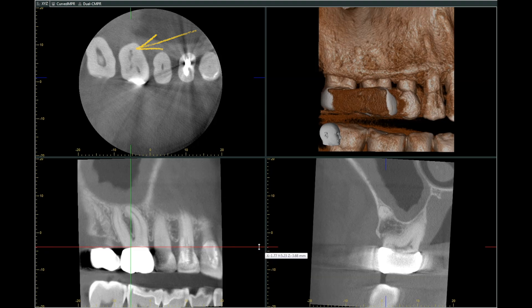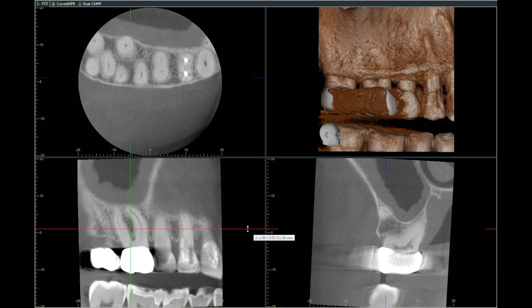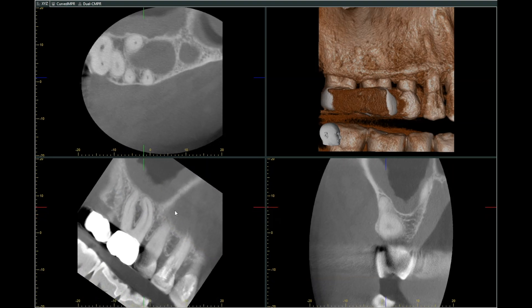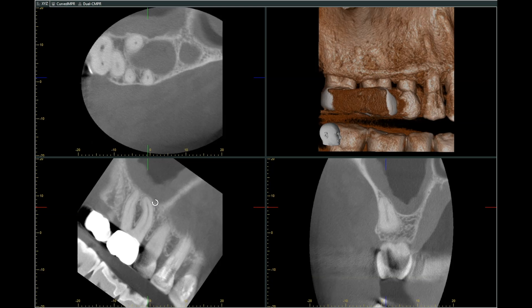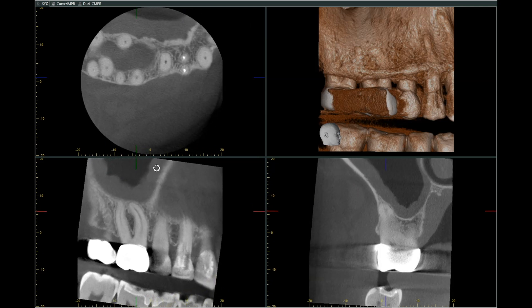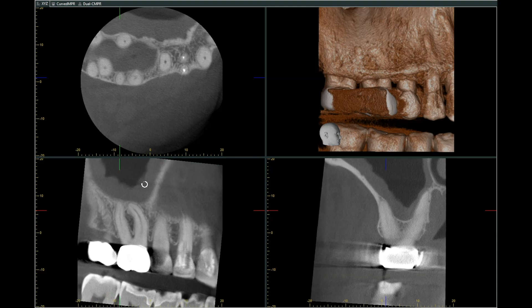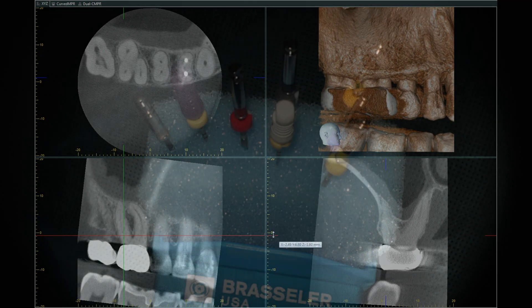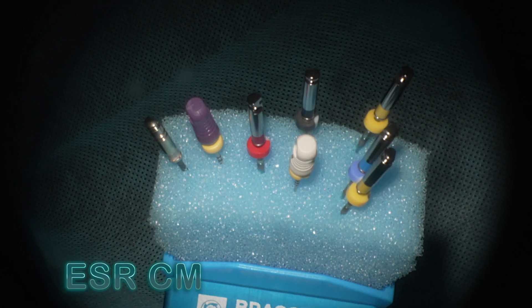On the CBCT axial section, this tooth also had a little bit of internal root resorption, which is usually a sign of chronic infection and inflammation. Isolating the mesiobuccal root, we can see a bifurcation at the apex on the MB1, and the MB2 is present but disappears somewhere in the mid-root portion of the tooth based on CBCT analysis — so we can anticipate that ahead of time.